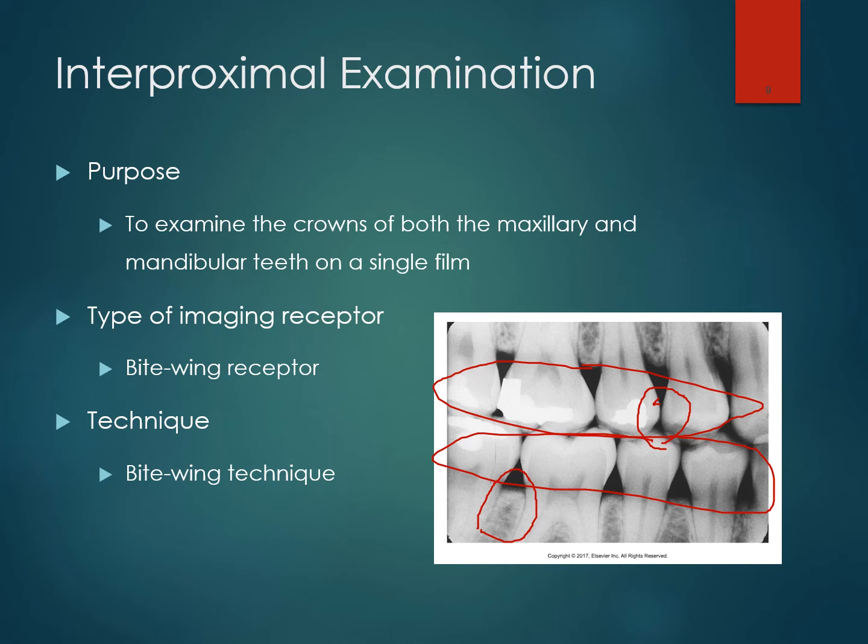What you'll see when it looks, none of these are really overlapped. This one's pretty close, but it's not. It's mostly just the whiteness of this silver filling right here. If the area in between these two teeth has kind of a little lighter space in between the two, then that means that the contacts are overlapped. And that would be grounds for having to take a retake of this image. So it's very important, one, that we're able to capture both the upper and lower teeth on the same film, but also that we are opening the contacts too.